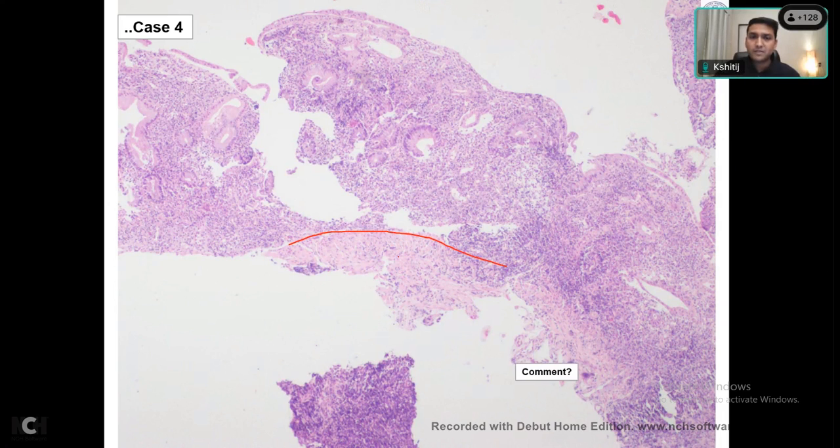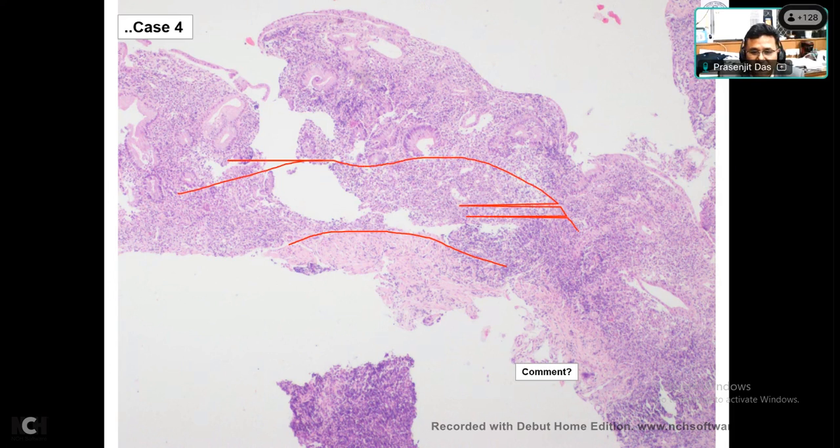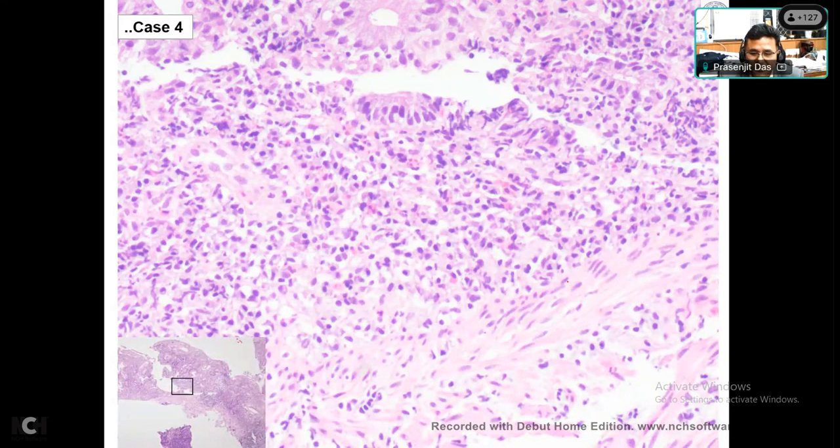The basal plasmacytosis. Yes. So, as the architecture is distorted, the crypts are short. So there is a zone in the basal part. This is called the basal zone, I told you. And you have to go into high power. And in this case, almost all fragments are showing basal plasmacytosis. Yes, sir. This is definitely important. So this is the high power. This is the muscularis mucosae. This is the deepest part of the crypt. Sir, you can see, I think, this is basal plasmacytosis.